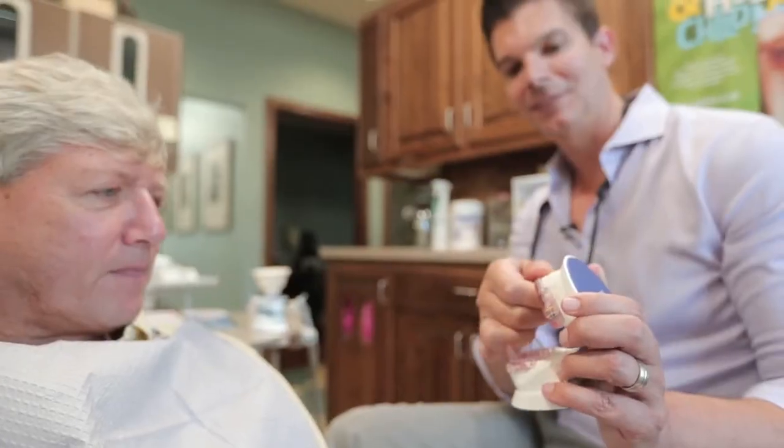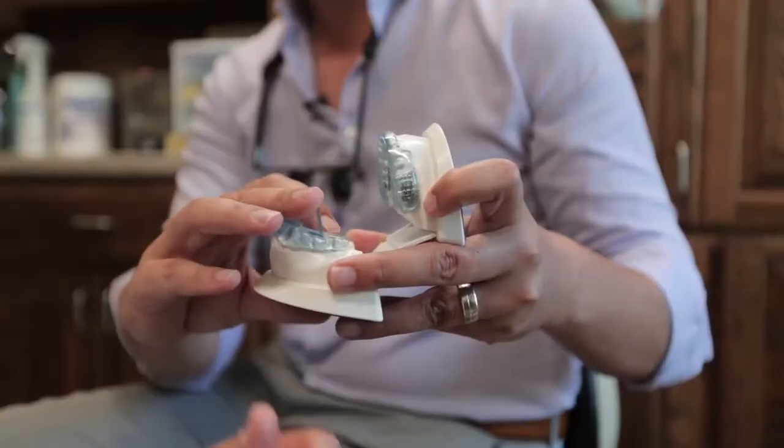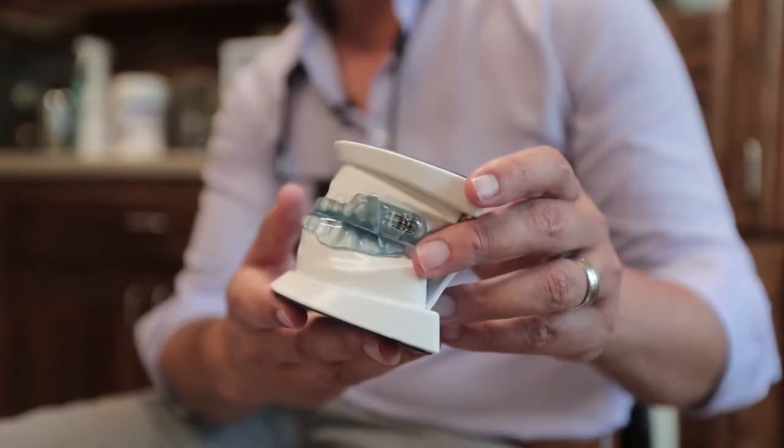There's going to come a point where you and your patient sit down and recognize that an oral device is their best option, because most people fail CPAP. The efficacy of using an oral device, especially when you make one by Somnomed — they're super comfortable, they fit well, and they're very streamlined. Over 90% of your patients are actually going to follow through. And isn't that what we want?